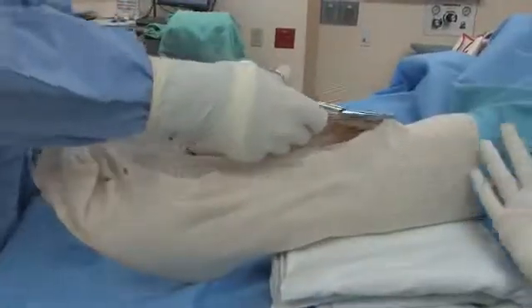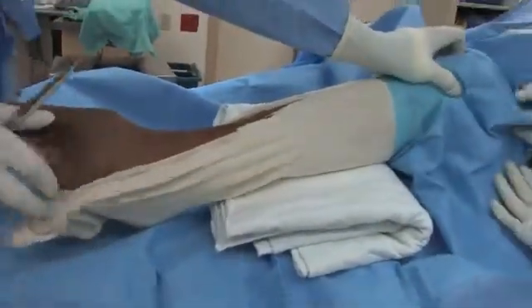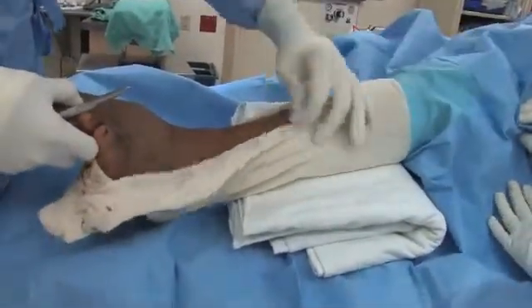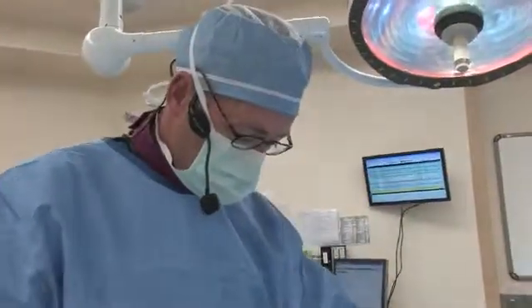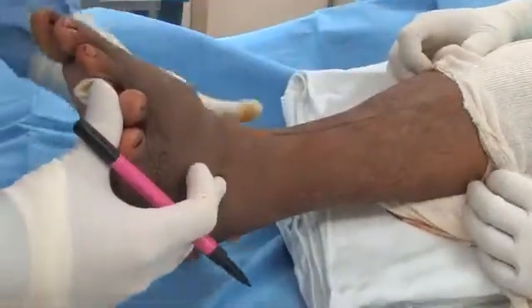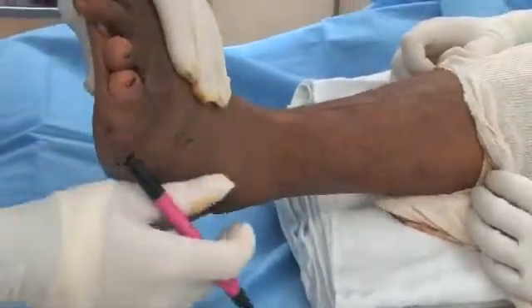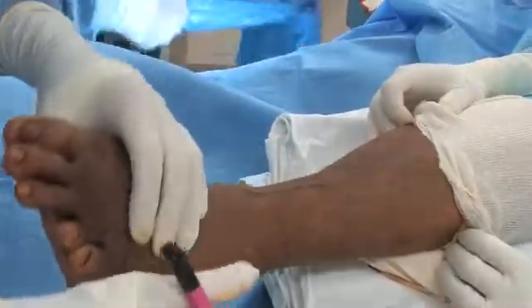So the landmarks I'm going to look at right now: I'm looking for the patella, which is right here, and the second toe. This will give me an alignment where I'll find the tibial tuberosity. When I place my ring on here, what I'm using for landmarks on my tibial ring block is my bisection of my tibia, and then on the foot plate, I'll use bisection of the calcaneus.